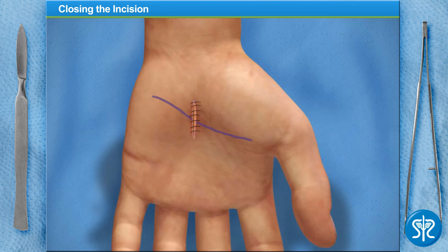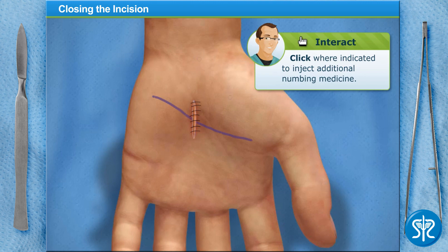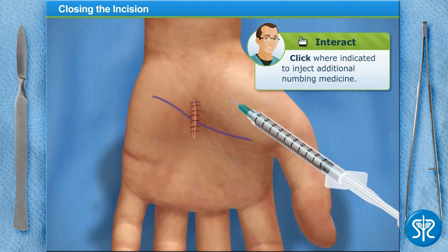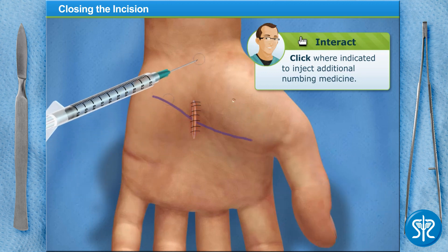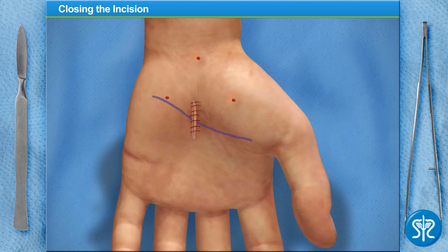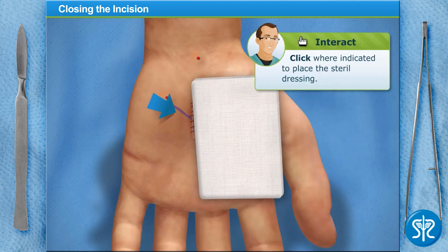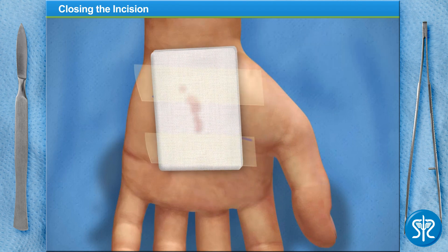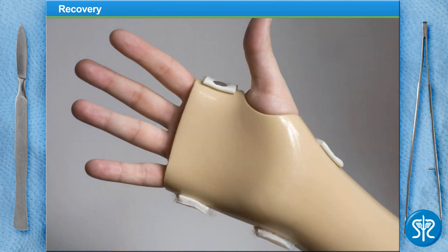With the wound closed, we'll inject additional numbing medicine around the operating site to help relieve some of the immediate pain the patient may feel after surgery. And lastly, we'll place a small dressing over the wound to absorb any residual blood. We'll immobilize the wrist with a splint and a sling, and after one to three hours, our patient is sent home to recover.